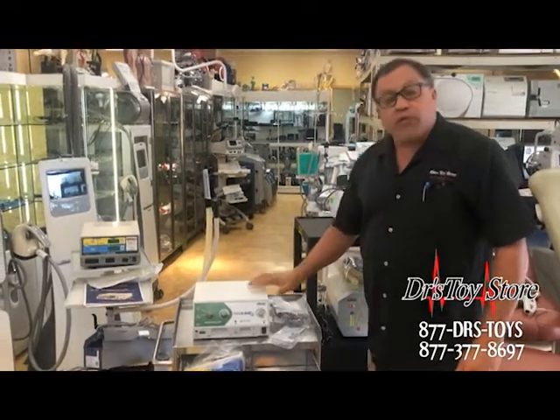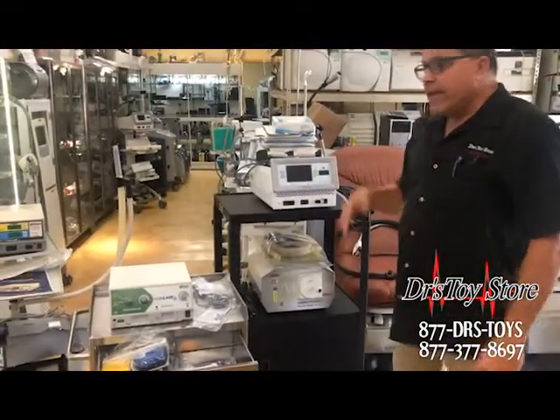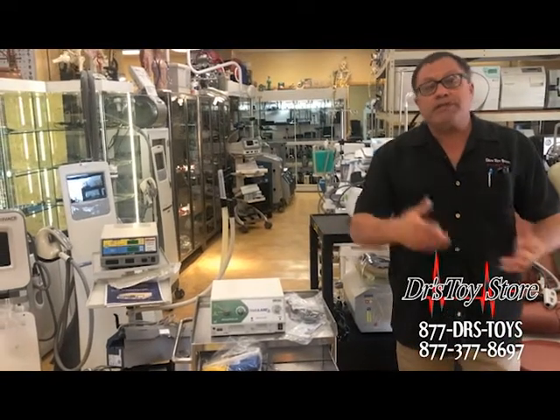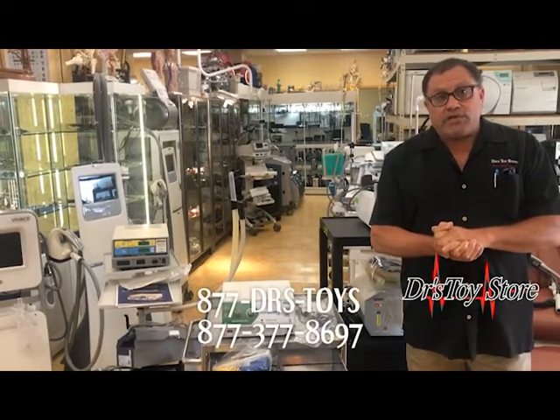They also come with a full warranty from Sinusure. They're brand new in boxes. So whether you need a 4.0, an Ellman Pelleve, FFPF, dental, surgical, ophthalmology, or you just need a simple repair on your Ellman, call the Doctor's Toy Store at 877-DRS-TOYS today.